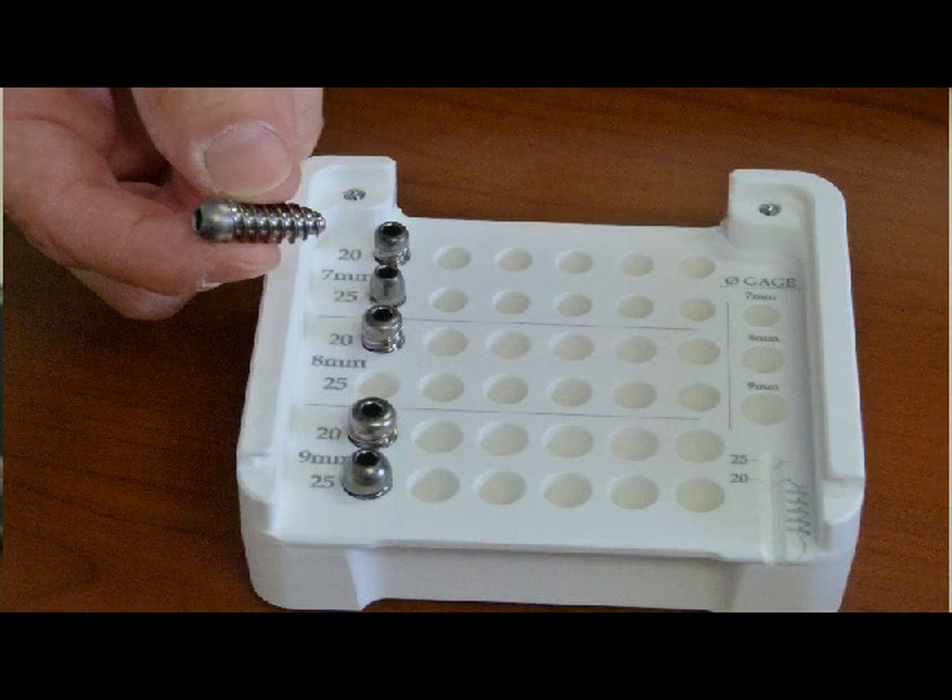And these screws are used to really reconstruct the ACL and the PCL.